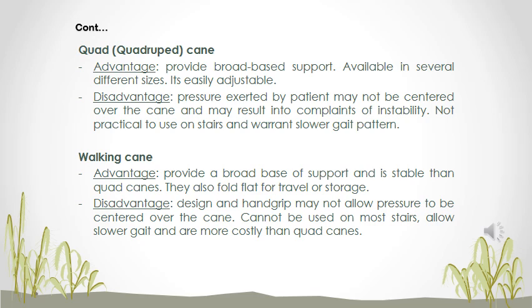When you look at a walking cane, the advantage is that it provides a broad base of support and is more stable than a quadrupod cane. They also fold flat for travel or storage. Disadvantage, however, is the design and the hand grip may not allow pressure to be centered over the cane still, which we've seen in different canes as well. And also the challenge with climbing stairs. This also causes a slower gait pattern and often is more costly.